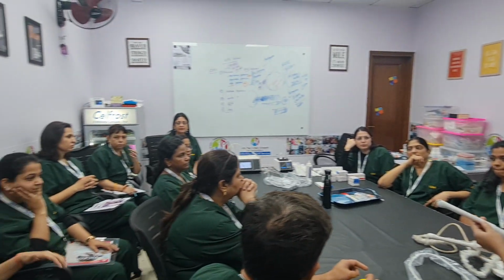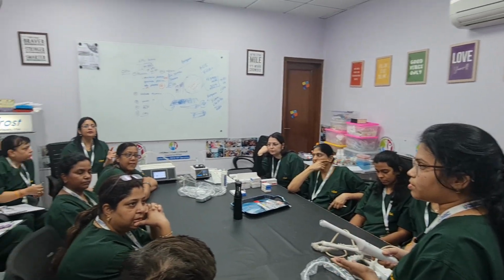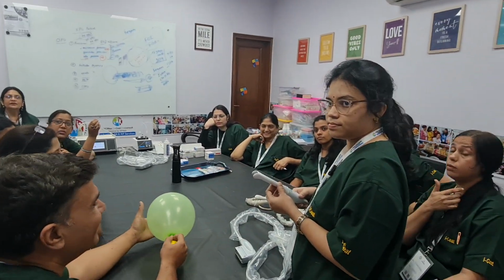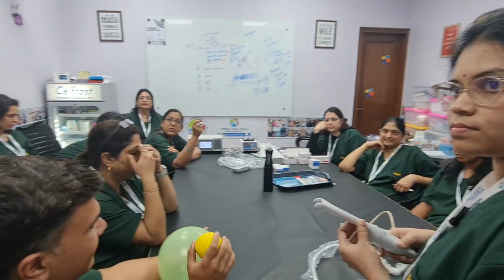2D is generalized, 3D is more specialized, specifically when we're looking for clarity. Even uterine anomalies or fibroids are beautifully seen. Depending on the days of the menstrual cycle, one can diagnose the polyps. 3D is a volumetric probe, and 2D is B mode, which should be gray scale. But to calculate volumes and look at the features and proper morphology, irrespective of any part of the cycle, 3D is more useful.